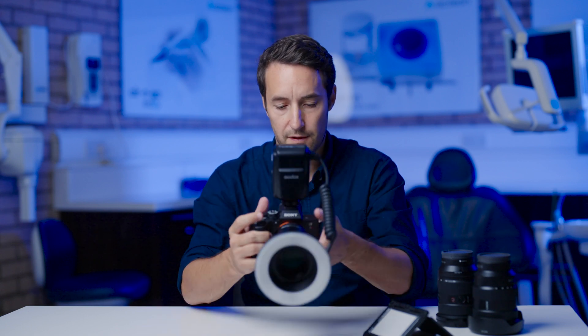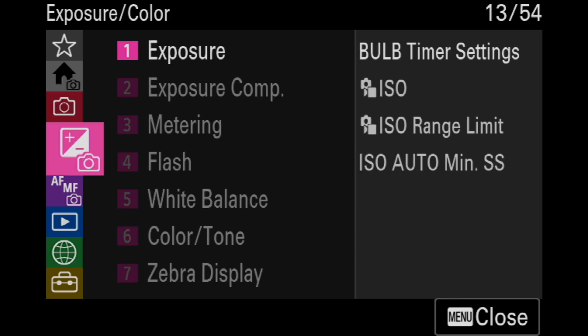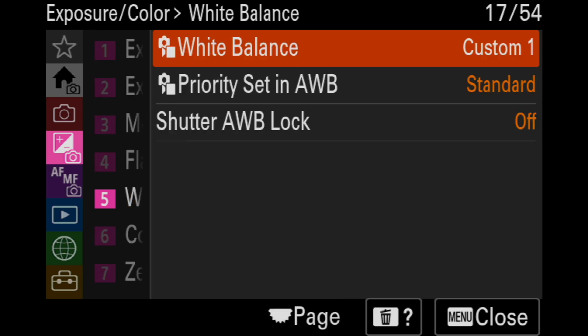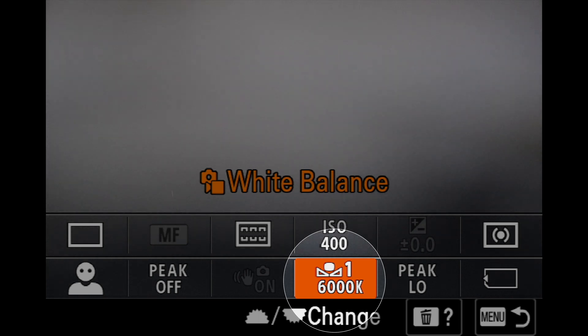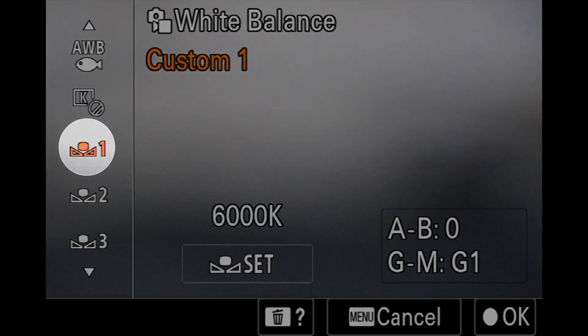The first thing we need to do is go into the menu system, go to the exposure colour menu, go down to white balance, click on white balance and then go down to custom. You can also do it through the function settings — press the FN function button on the back and scroll down to custom settings, say custom one.